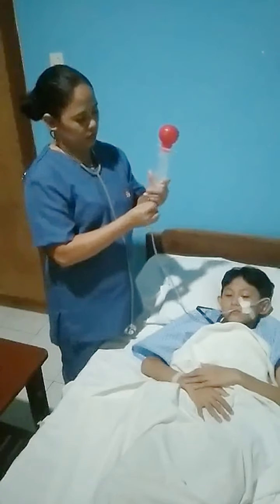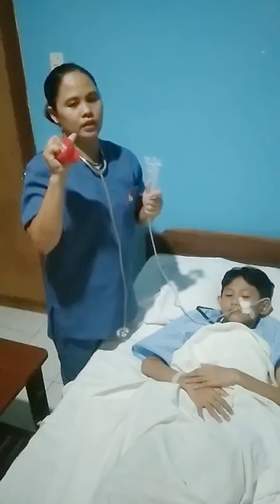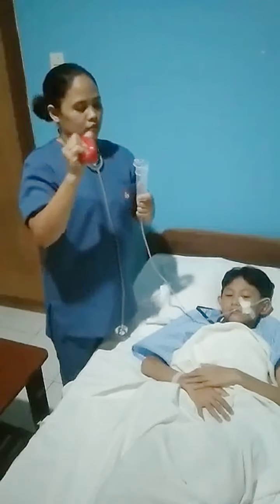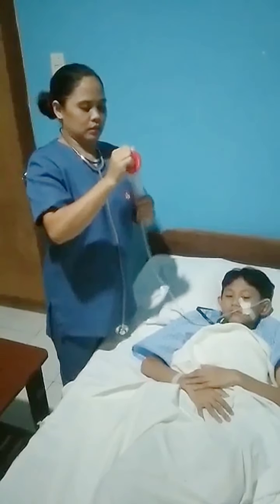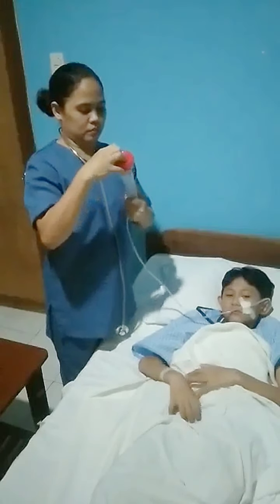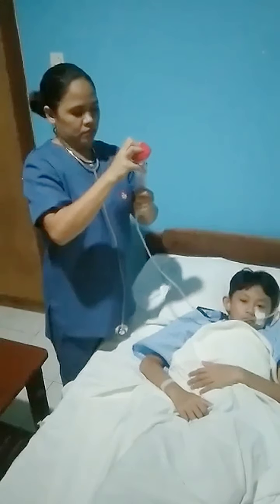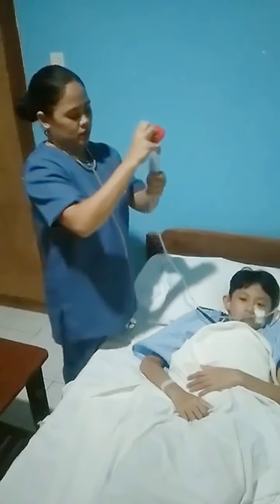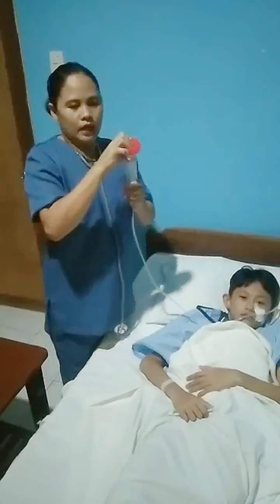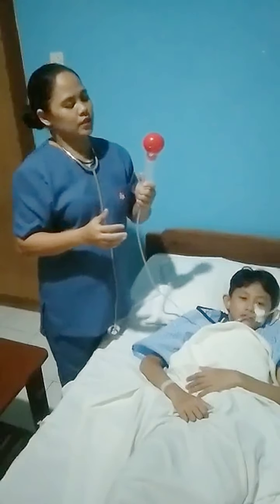Kink, open the cover, press the cover to create a suction or a vacuum effect. Put it back. Release the kink, and then check the aspirate and measure the residual.